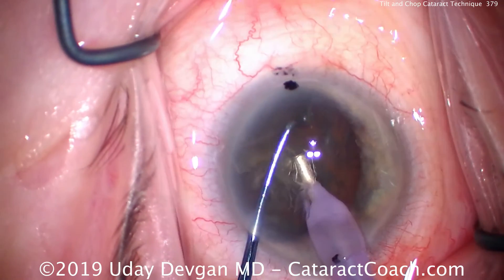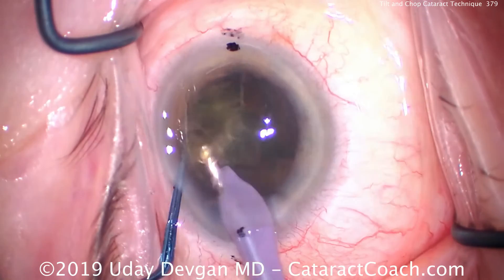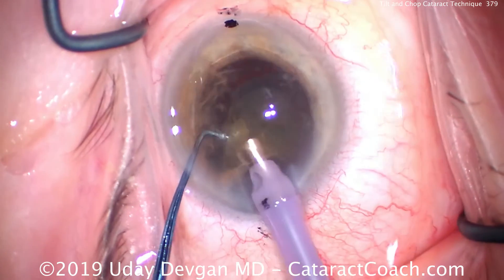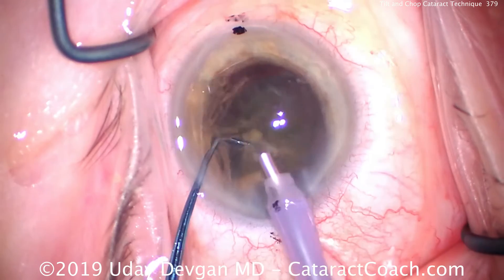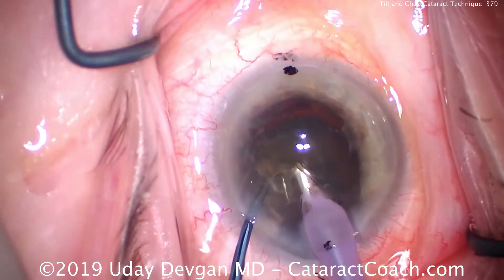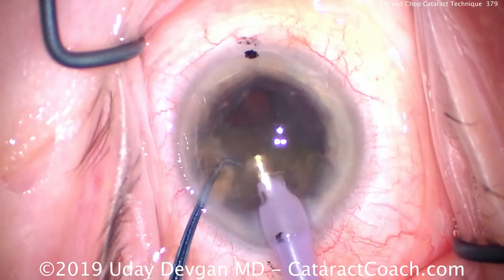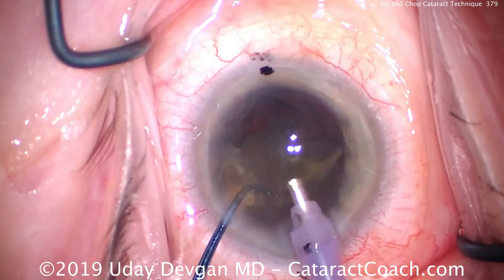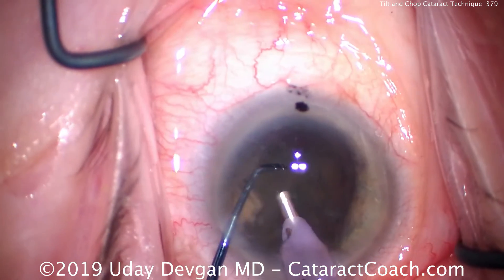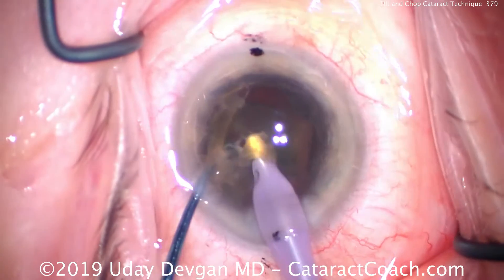This is a relatively dense nucleus with good fibrous nature, so it requires a few different chops. With those first two chops, we're able to aspirate out about a quarter of the lens nucleus. Buzz in again, and look where the chopper goes behind the nucleus. So if the lens is tilted up on its edge, the phaco probe is on one side and the chopper is on the opposite side. Phaco probe on one side, chopper to the other side — together and apart — and you can break off a little piece at a time.